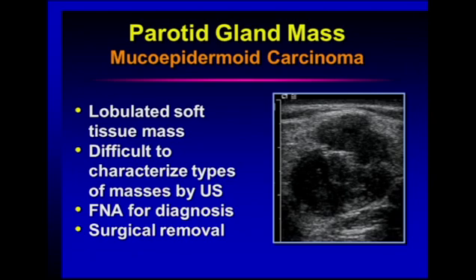Often surgery is recommended for the benign masses as well, just because they can continue to grow and cause local compression of structures, and so they're often removed surgically as well. But the clinician does want to know what type of mass they're dealing with within the parotid gland, so the reason to do the FNA.